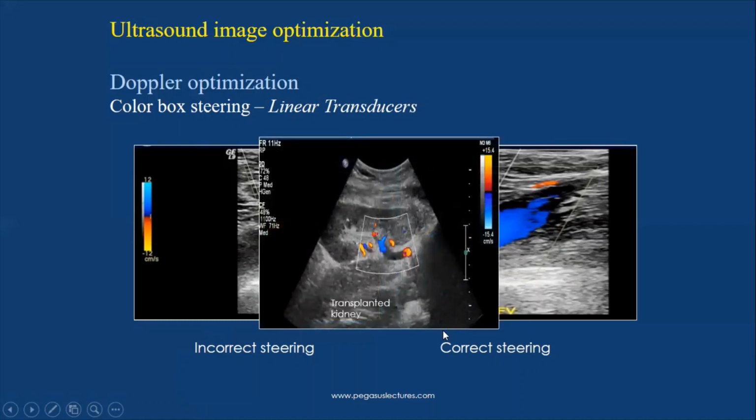This is a nice case of one of my patients. This is a renal transplant, the right lower quadrant. In this convex color flow setting, we can see 3 colors. This is blue, red, and signal void here in the main renal vein. So if I want to ask what this vessel is, how can you answer?